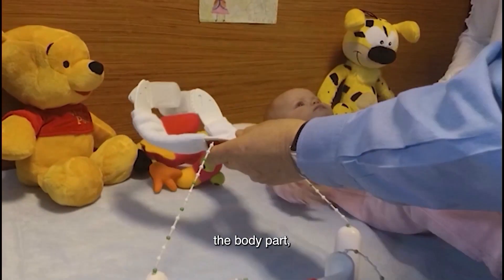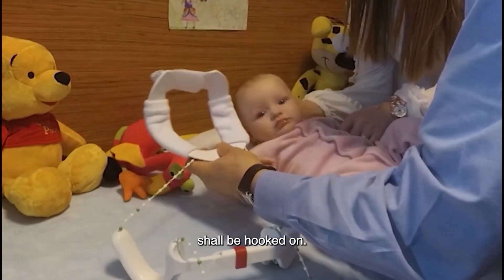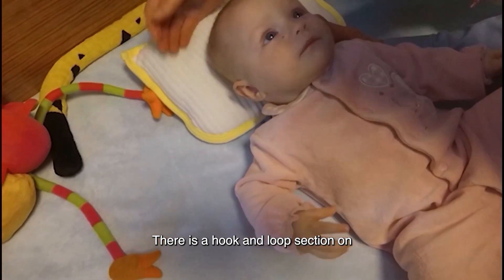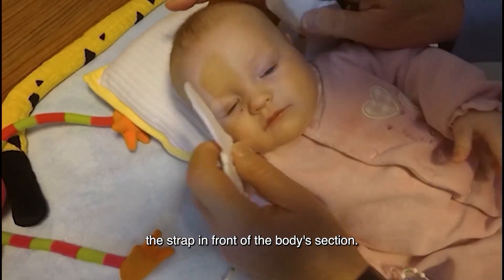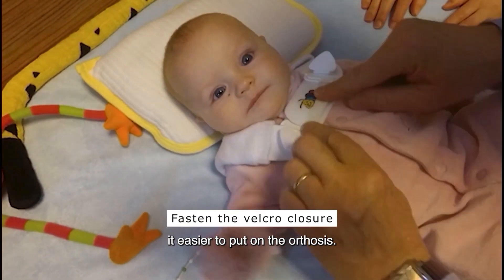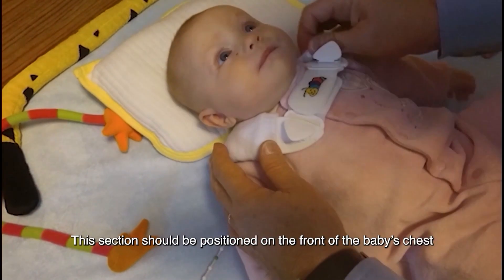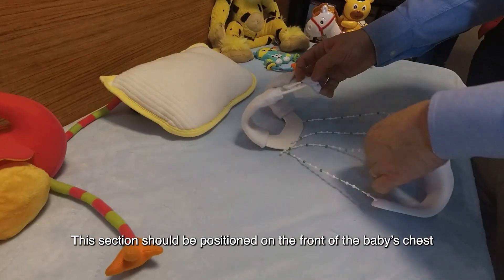First, the body part — which is the shoulder harness of the orthosis — shall be hooked on. There is a hook and loop section on the strap in front of the body's section. This velcro section with a caterpillar mark makes it easier to put on the orthosis, and this section should be positioned on the front of the baby's chest.